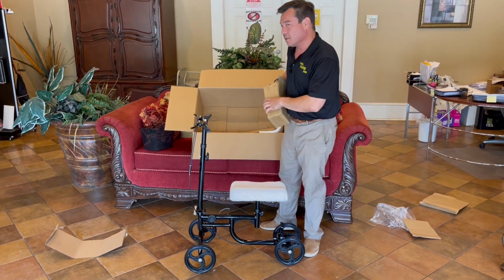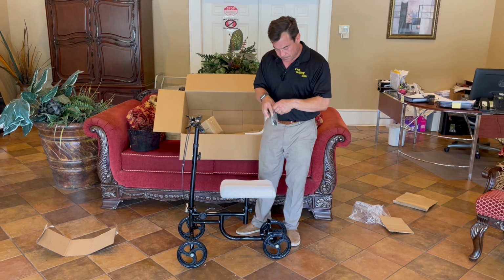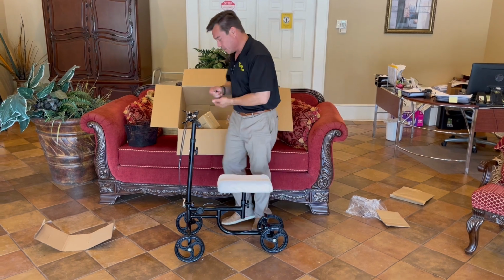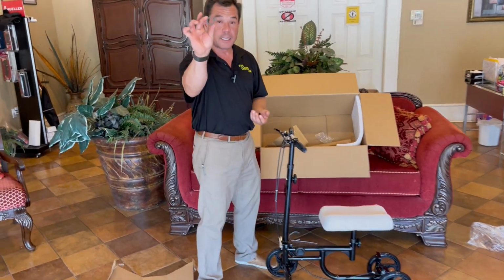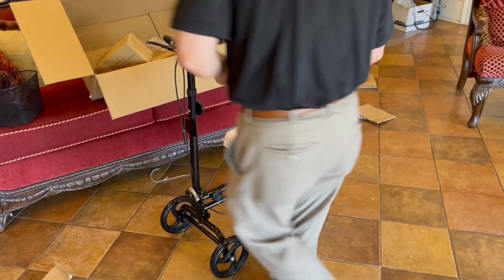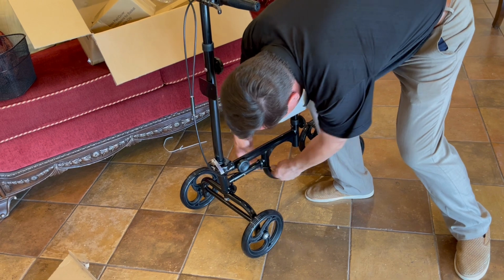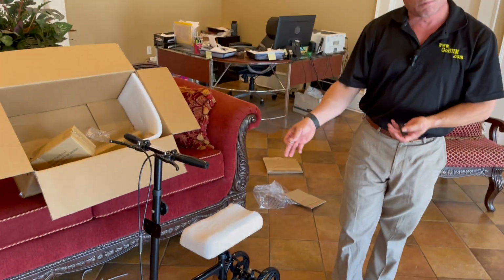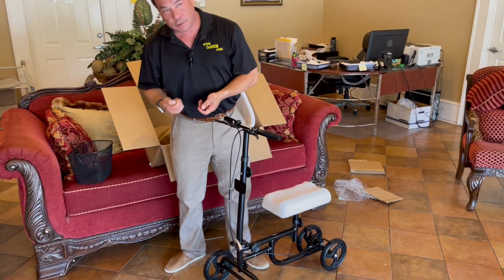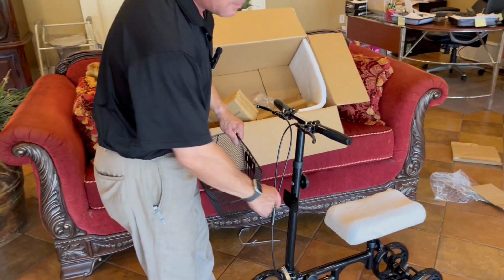And what else do we have in here? Well, we have little nuts, bolts, and an Allen wrench. Okay, so some of the other things. We also have a cable clip. What this cable clip is for is so that you can take it and clip it to the tube here. This is to keep the cable up off the ground as well. We've remedied that a little bit by putting it through the body there. I'm sure that the company that manufactures this sees that and probably says, oh, you're not supposed to do it that way. Well, we do.